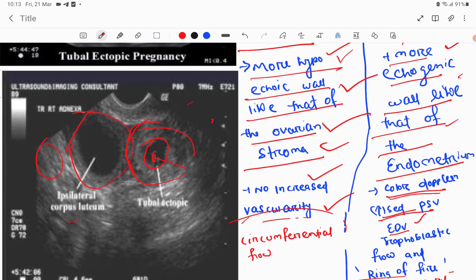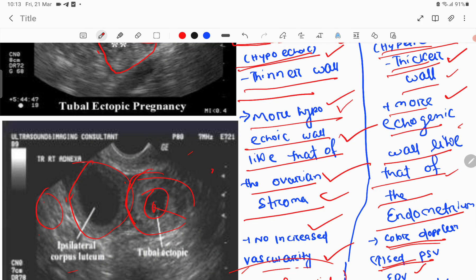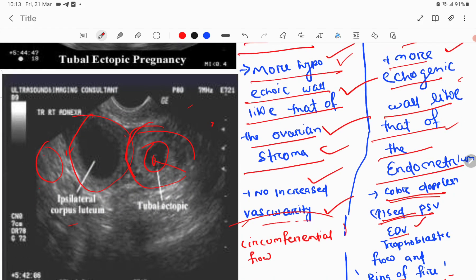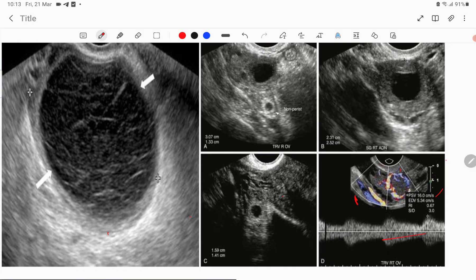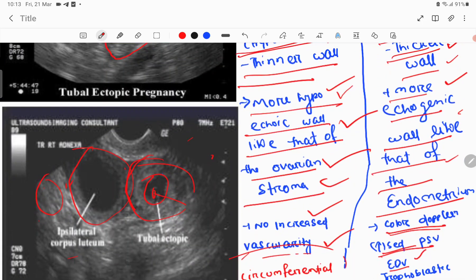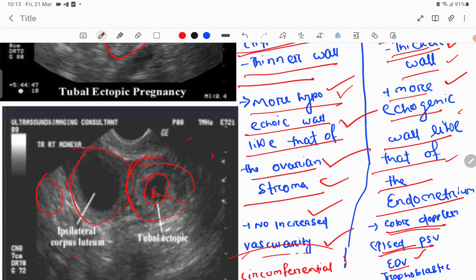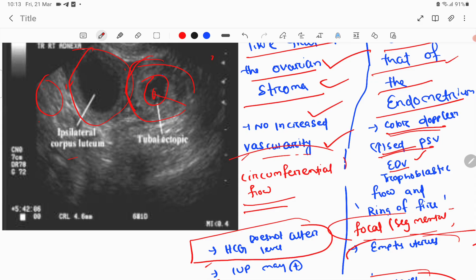Regarding vascularity: the corpus luteum is less vascular with no increased vascularity. In ectopic pregnancy, vascularity is increased — this is the 'ring of fire' appearance. Blood flow in the corpus luteum is circumferential, whereas in ectopic pregnancy it is focal or segmental. The color Doppler shows increased peak systolic velocity and end-diastolic velocity due to trophoblastic flow, producing the ring of fire sign.